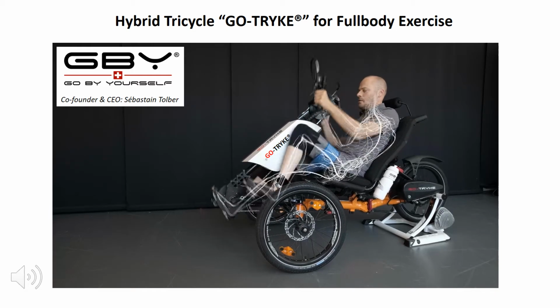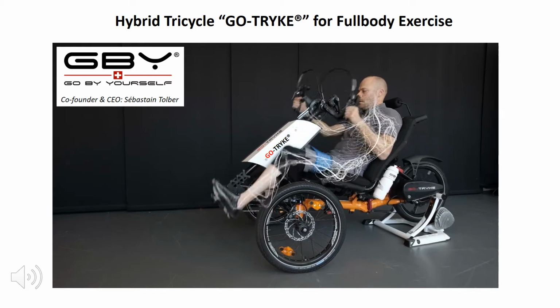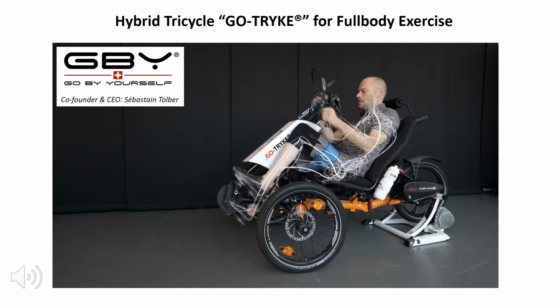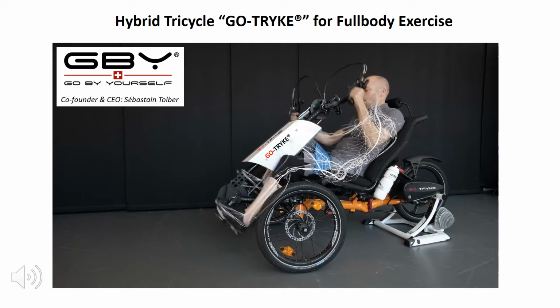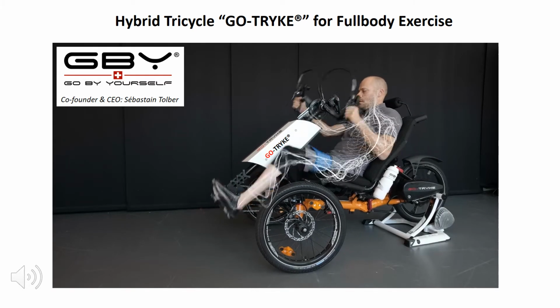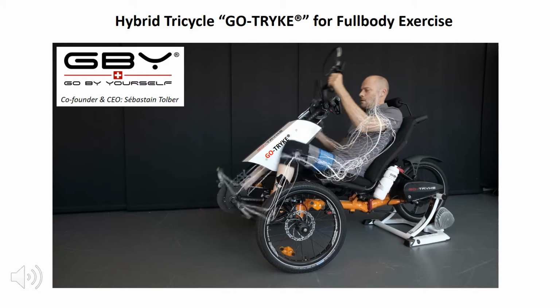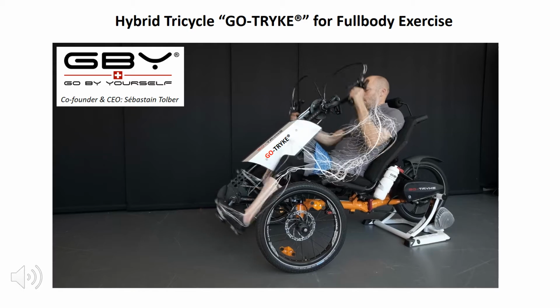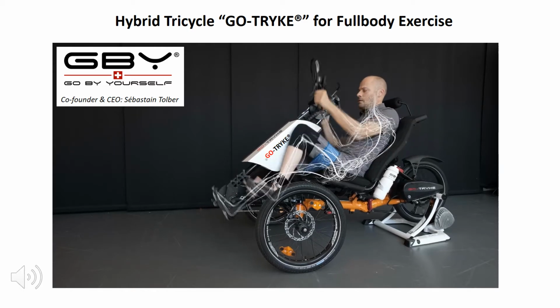What we can do now is to combine this device with our electrical stimulation so that he's stimulating his muscles at the same time. And that is what we're working towards in the future. And hopefully we can collaborate with Sebastian with our work and develop an even more advanced device to do this.